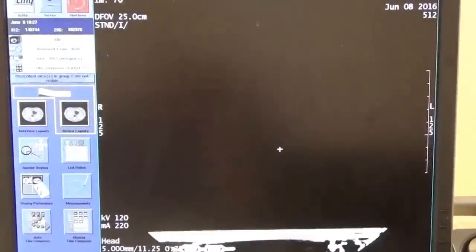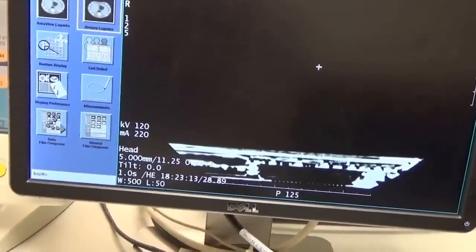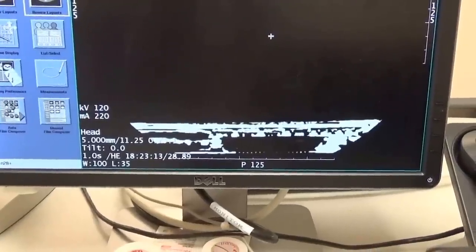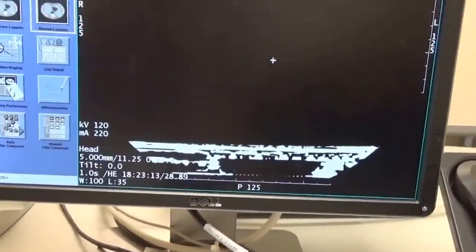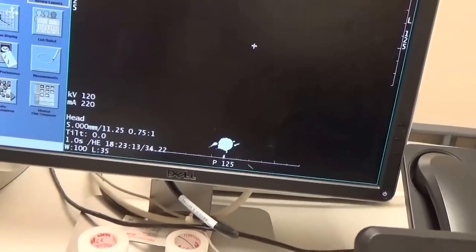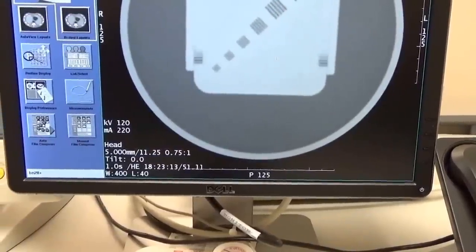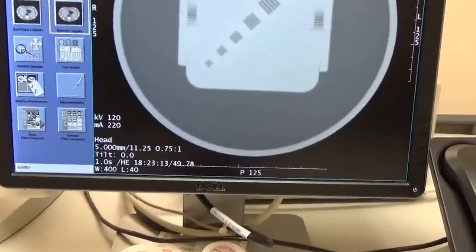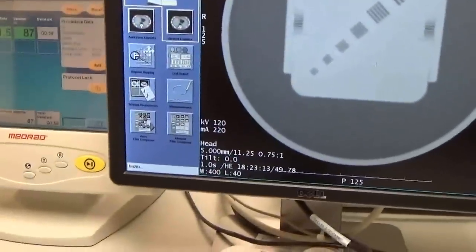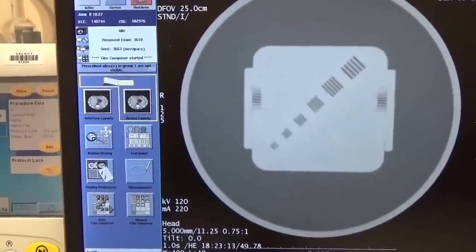And then we're getting into all the fun stuff — like that metal — and there's our laptop computer. We can change the contrast, just kind of adjust it. These are the slices. There's an idea of how a CT works — basically how to take an x-ray, how to take a CT of a patient, and how it works. This is basically what they're seeing when they x-ray you.